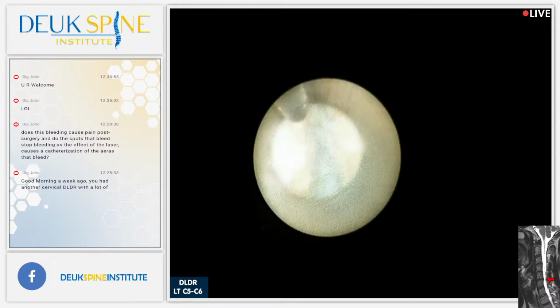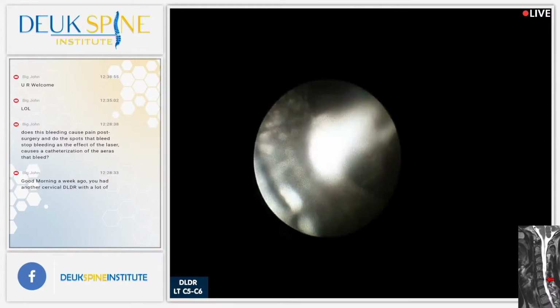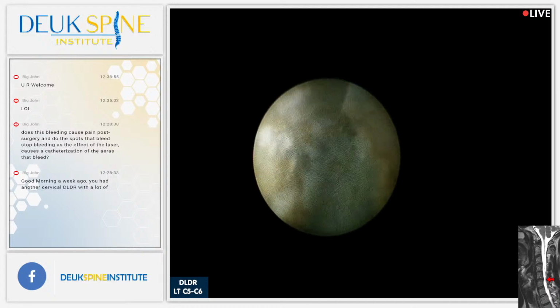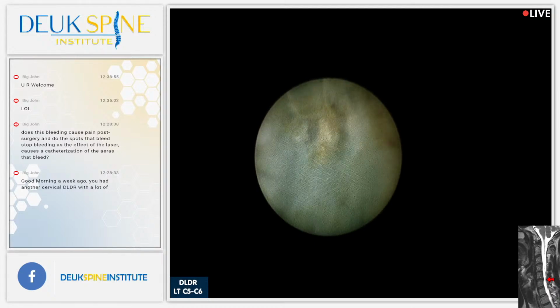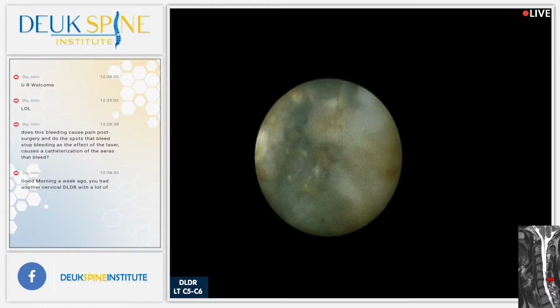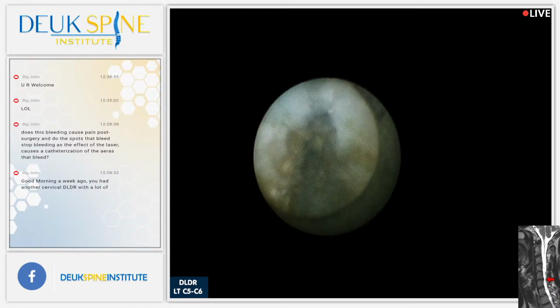Yeah, I've just got to clean a little more out. All right, Henry, what other questions you got? No current questions. We just have a comment from Big John who says you are welcome. I think that was in the context of what you said earlier. Sure. All right. That's it. I'm going to come back and look at that left side one more time, and I'm off on his right side right now.